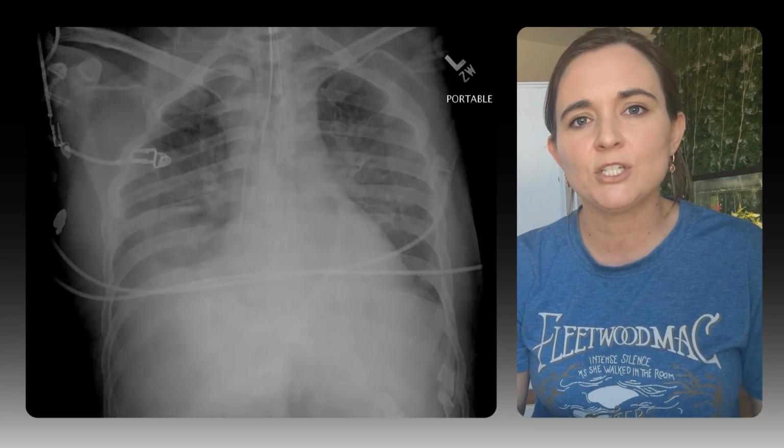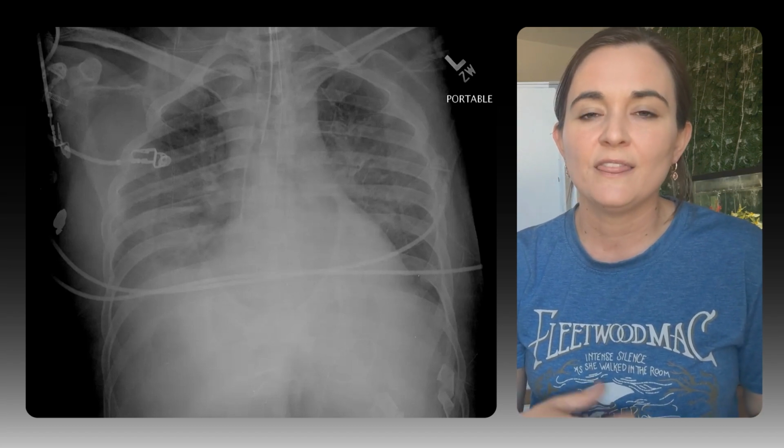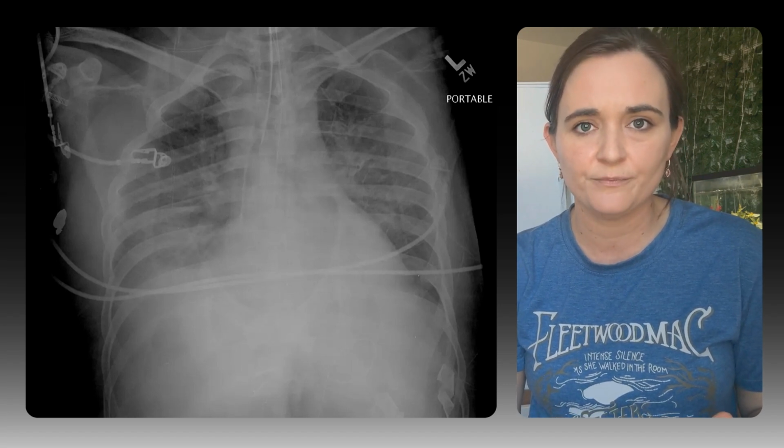Or maybe your image has ghosting, which is a faint duplicate of the anatomy. That's a CR plate erasure error. Run an erasure cycle and repeat the exposure. And if your AEC keeps overexposing obese patients, override it. Use manual techniques, 85 to 90 kVp, high mAs, and a grid. ALARA still applies, but diagnostic quality comes first.